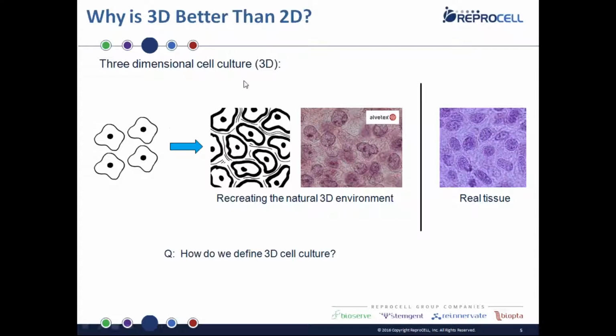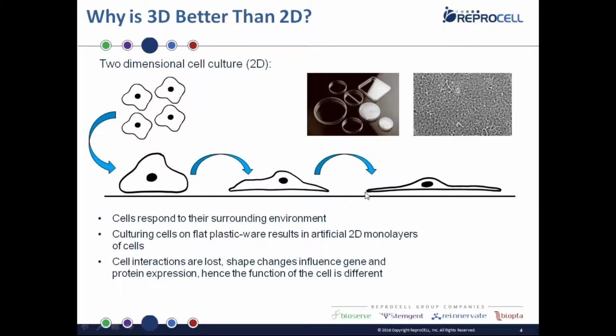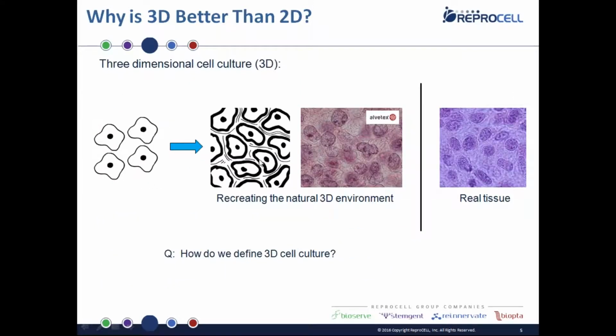And if we go to the next slide, so just to recapitulate, here is the cells in vivo, so it's very spheroid really, and it's got a lot of contact. And when you compare it to 2D, you can imagine how this is really just the only surface along which this cell is going to have a contact with its neighbor. Most of the surface is in contact either with a substrate or with the medium. And you can imagine how that is a very, very different environment compared to what the cells are used to here in the real tissue.